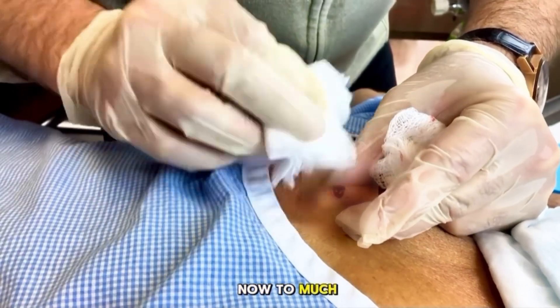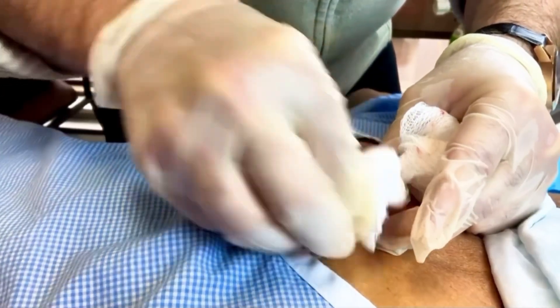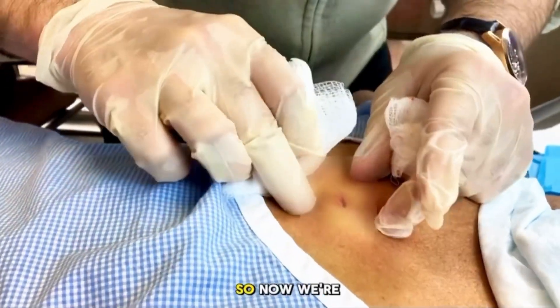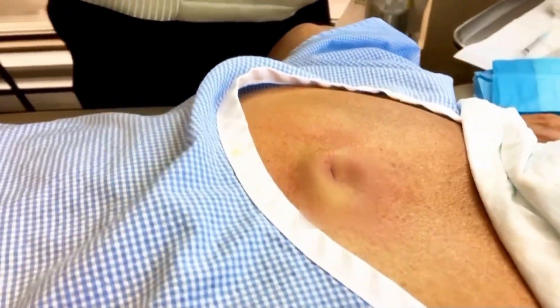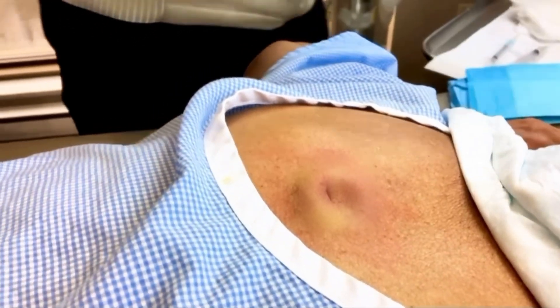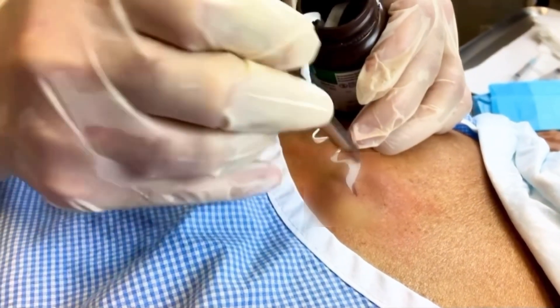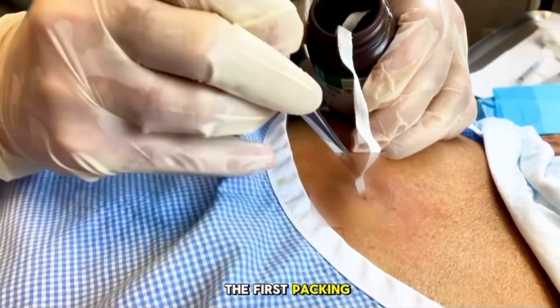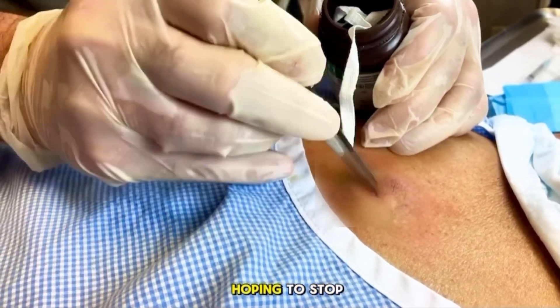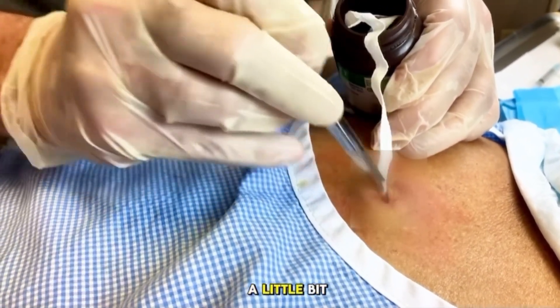You can see we're down now to much less coming out. So now we're at a point where we're just going to pack this. This is just sterile gauze that we use. On the first packing, you want to use a fair amount because you're just hoping to stop bleeding. Then on the subsequent days, we just use a little bit less.